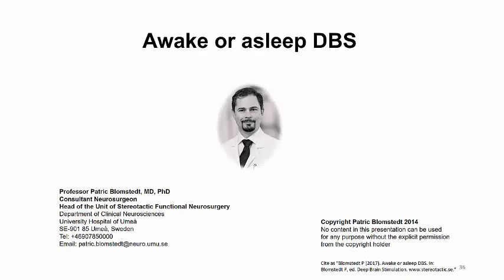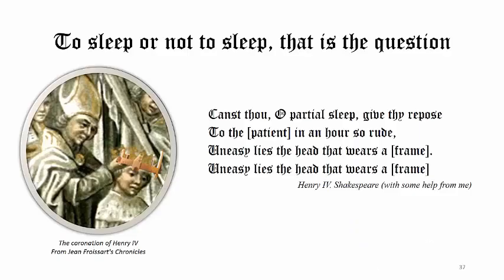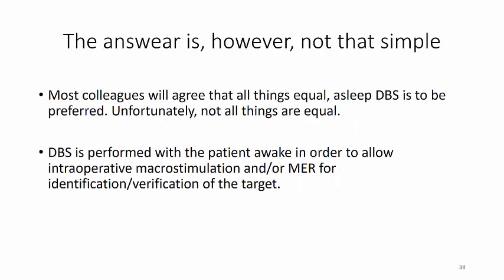So, the question is, awake or asleep DBS? Unfortunately, the answer to this question is not that simple. Most colleagues will agree that all things equal, asleep DBS is to be preferred. Unfortunately, not all things are equal. DBS is performed with the patient awake in order to allow intraoperative macrostimulation and/or microelectrode recording for identification or verification of the target.